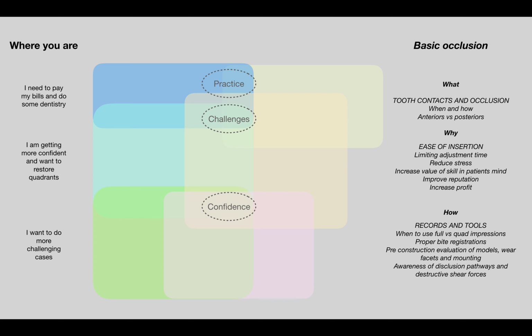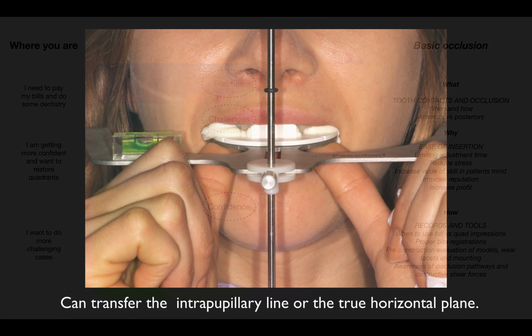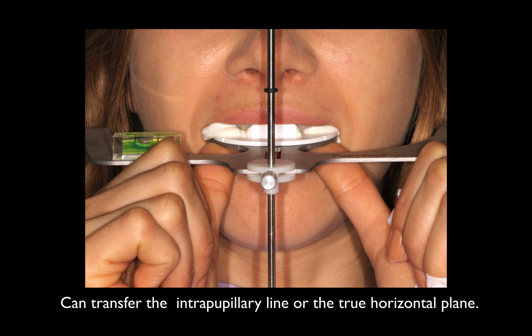Again, how do we do this? Well, we have to use the tools, but more importantly, we have to understand why we're using those tools, and that's what I want to talk about a little bit. We, of course, know that facebows and the Kois Dental Facial Analyzer can be used to help us with aesthetics. We can use it to transfer the interpupillary line or the true horizontal plane of the patient for aesthetics. I happen to like the true horizontal plane, so I just put a bubble level on my Kois bow.